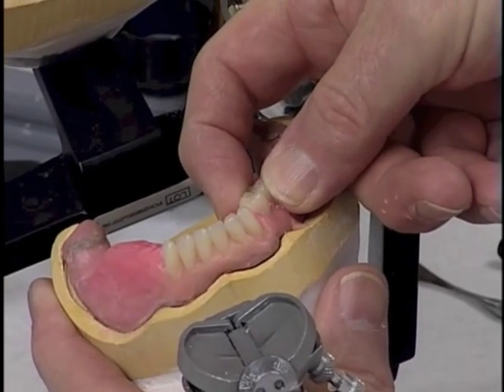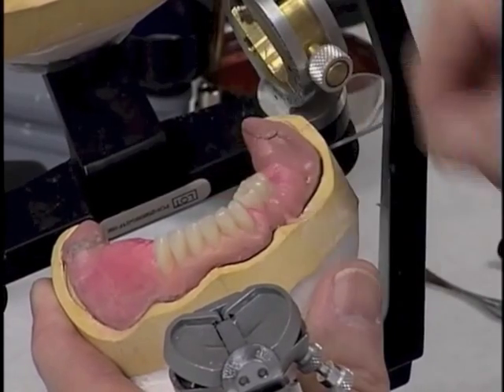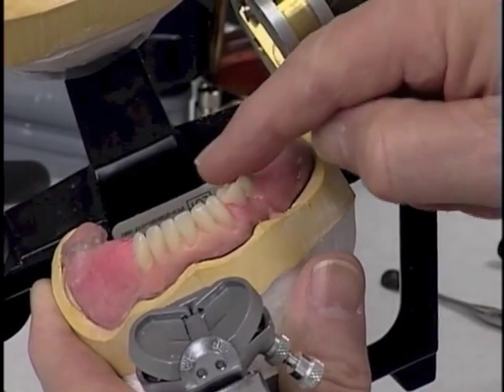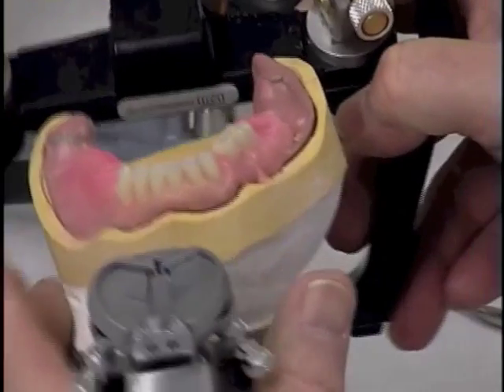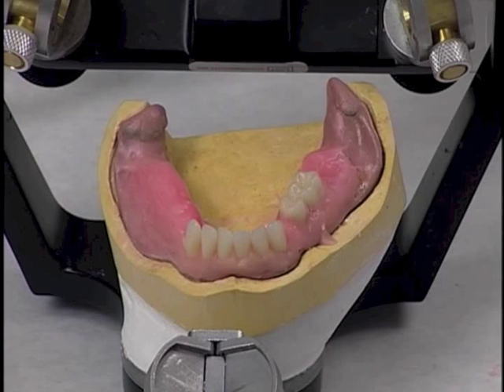It appears to be just slightly too far depressed on the lingual, so I'll raise that just a little bit, and that should give us now the beginning of a nice curvature that is going to extend from the canine tip through the second molar after the second molar has been properly placed. We're going to now place this second molar on the setup.